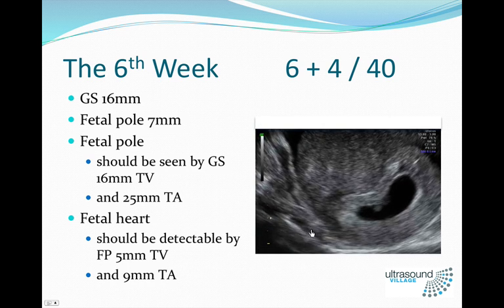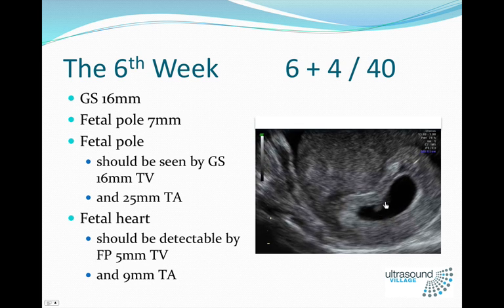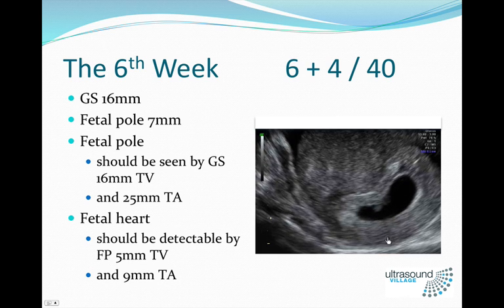Here we have a video of a 6-week and 4-day pregnancy. You can see here is a little 7 millimeter fetal pole. Watch carefully. You can see that heartbeat. The yolk sac in this case is just out of plane of this image.